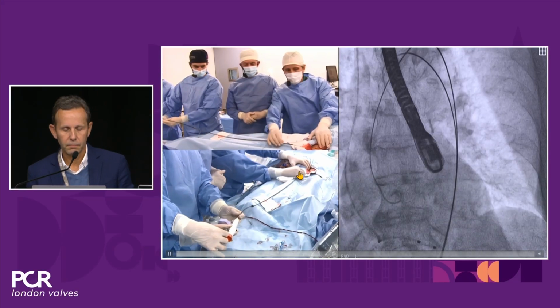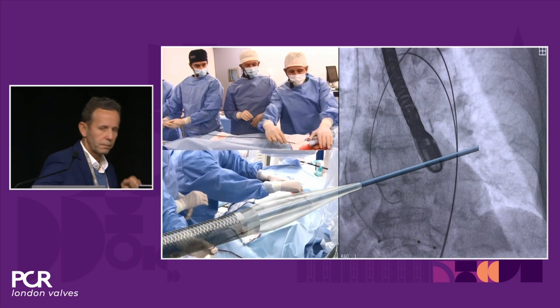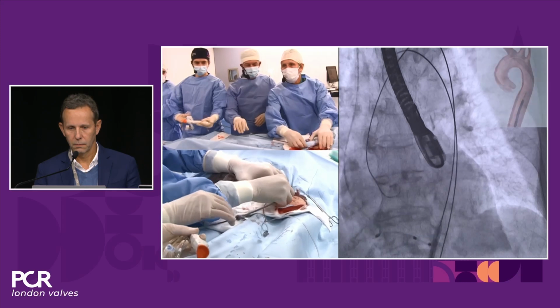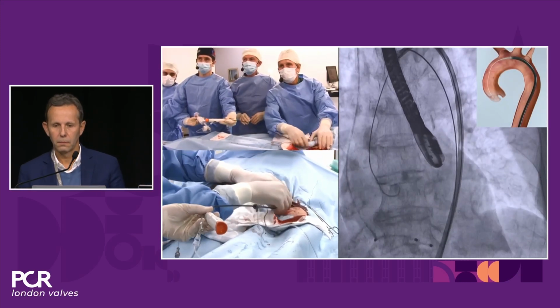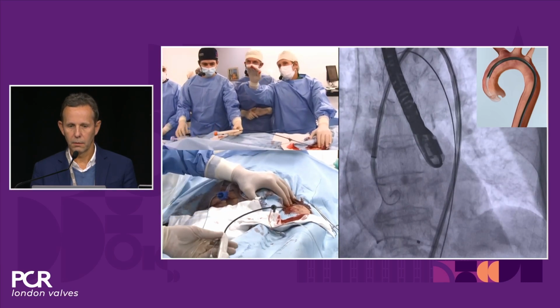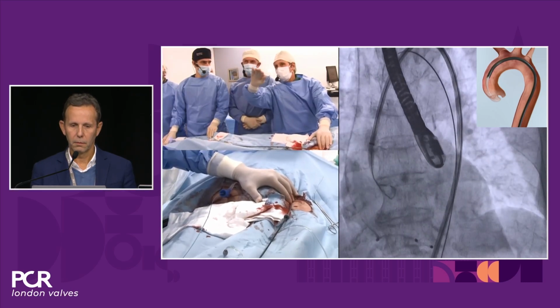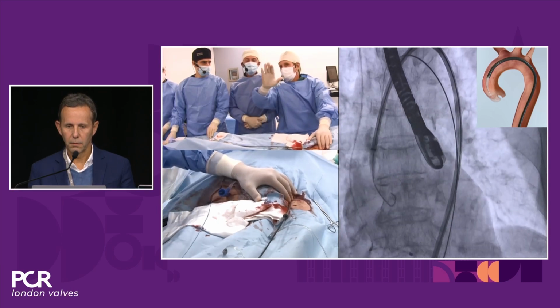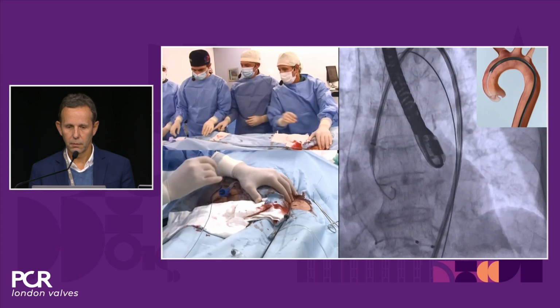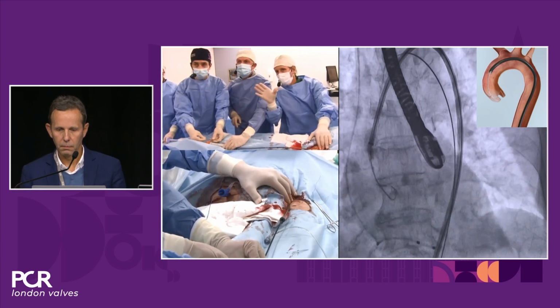Liner system. And you see at the tip we have a balloon that makes it easier to insert the device into the artery. Then we go all the way to the ascending aorta, as you can see here, with a stiff wire at the level of the STJ, and we leave it there, a little bit above the STJ, okay? So now we can see the mark in between the STJ and the level of the innominate artery, so that's the level we are aiming for, okay? Then we deflate the balloon and remove it, leaving the wire in place.